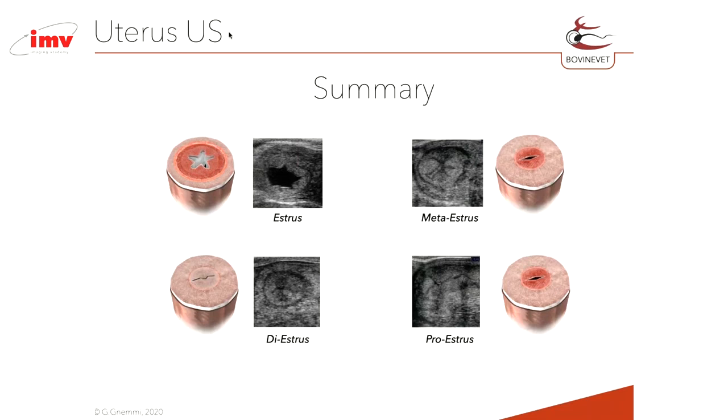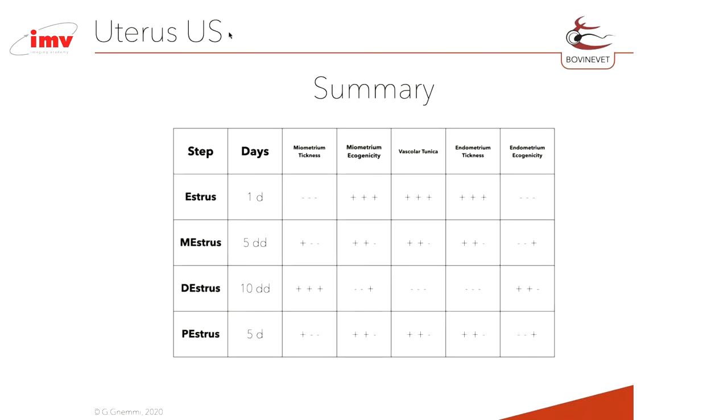And the endometrium reduces in thickness, so it becomes less thick, and in part absorbs, in part reflects the ultrasound, so it becomes more gray. So what happens during the luteal phase is that myometrium and endometrium become very similar in thickness and in echogenicity.